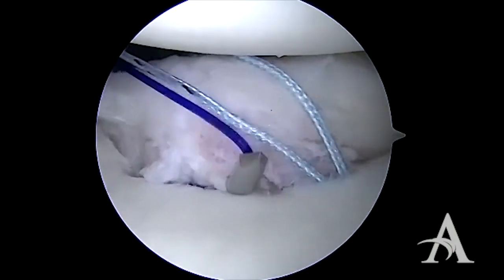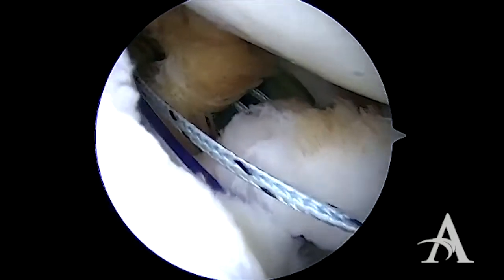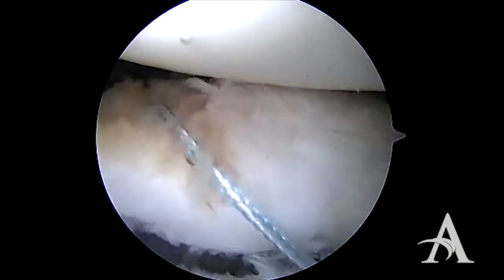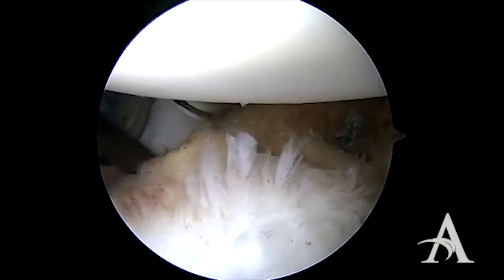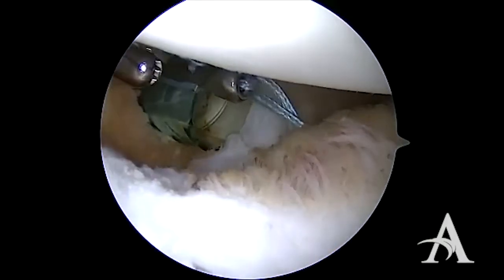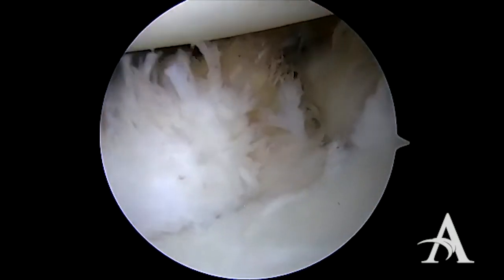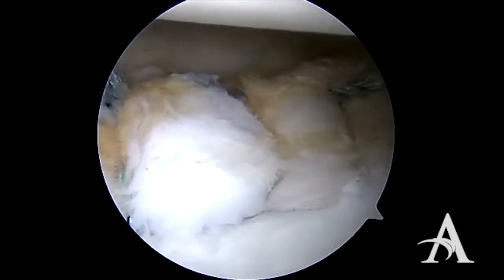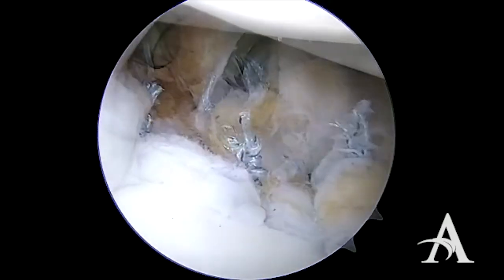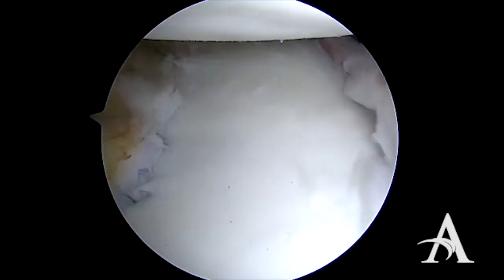There are some technical points that ensure the success of this arthroscopic procedure. It is important to mobilize the soft tissue to allow the labrum to be placed up onto the face of the glenoid in an anatomic position. Adequate preparation of the anterior glenoid with a burr is important to stimulate a healing response. The strategic position of portals will make any arthroscopic procedure easier to perform. Finally, our goal is to utilize a minimum of four to six anchors to ensure a solid repair and to decrease the risk of recurrent instability. In this case, six anchors were used, as can be seen from our posterior and anterior cannulas.